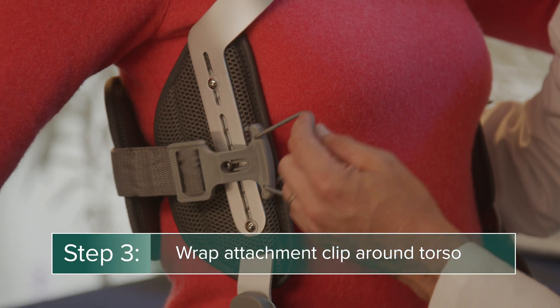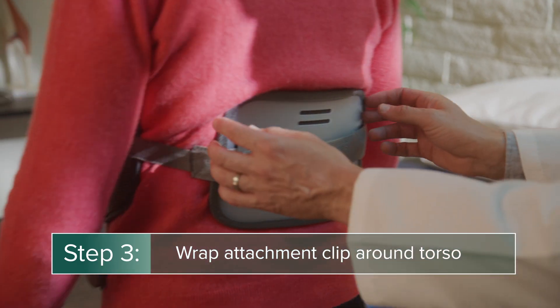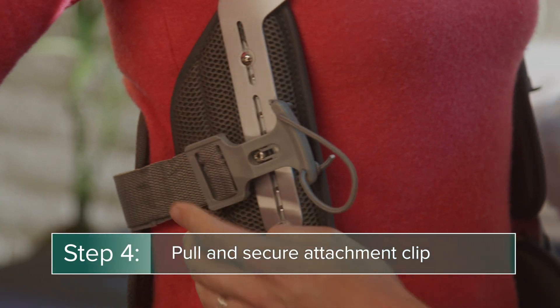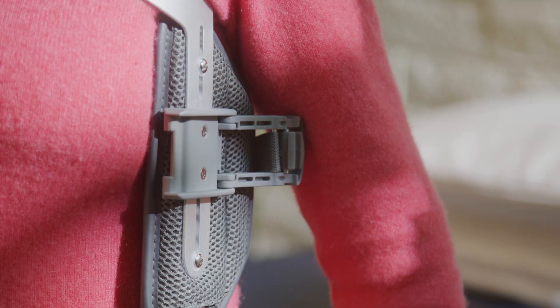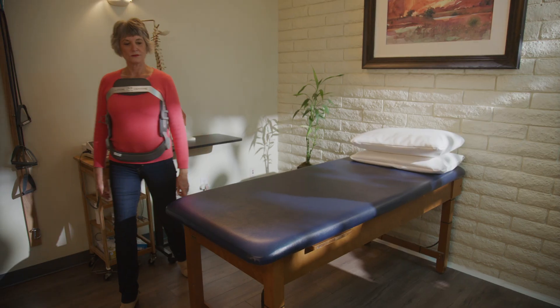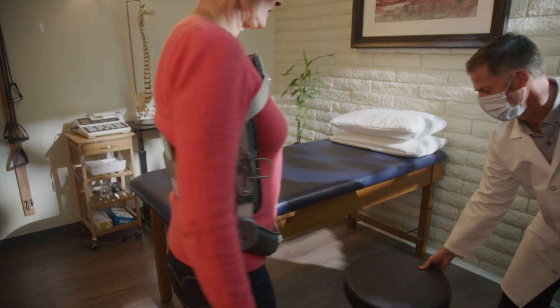Wrap the attachment strap around the torso, ensuring the posterior pad is centered on the back. Then pull the attachment clip over the right side and secure. Once the brace and strap are in place, close the lever latch on the left side to tighten the brace. The brace should stay in position and remain fixed with patient movement.